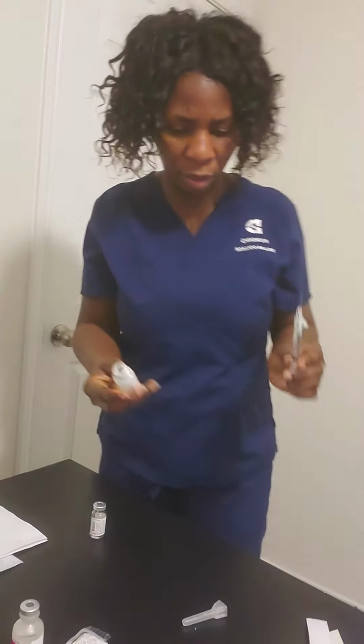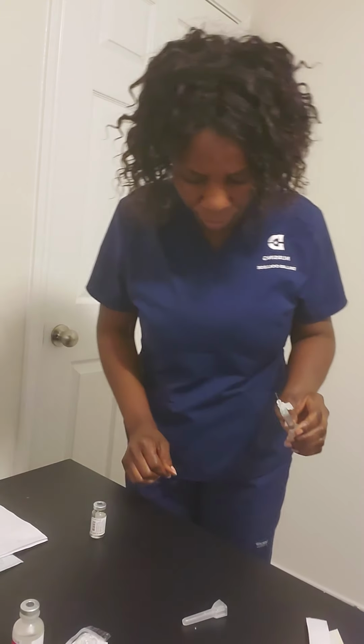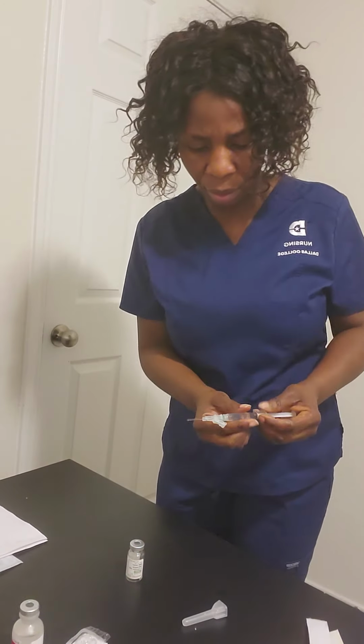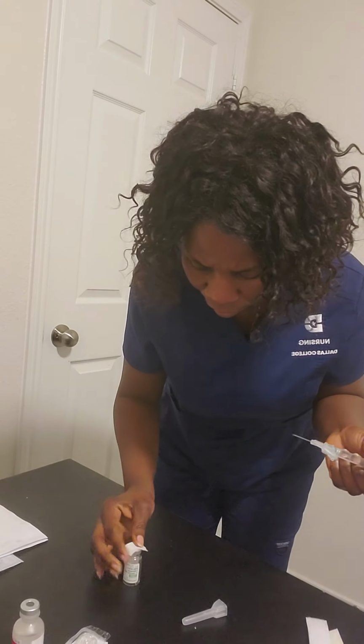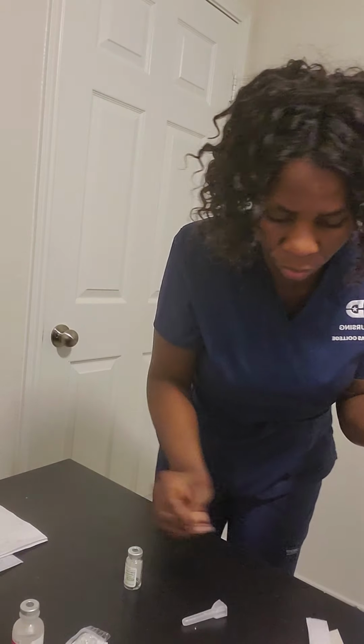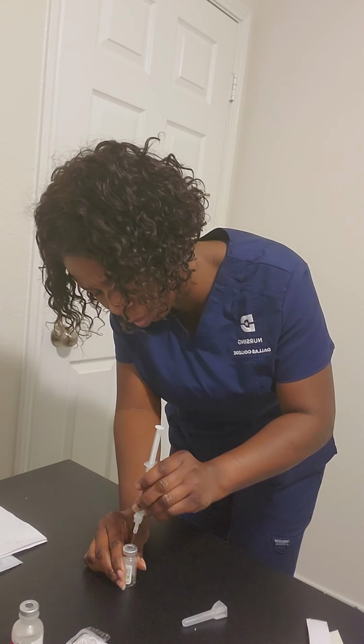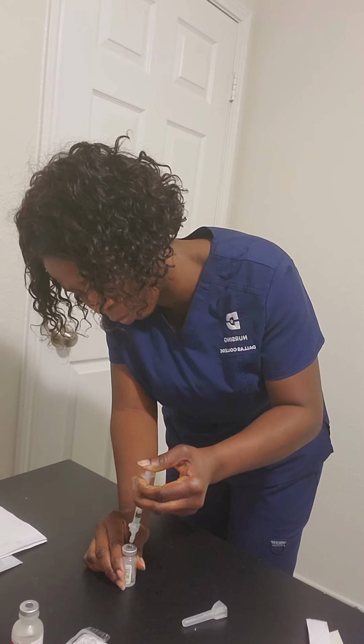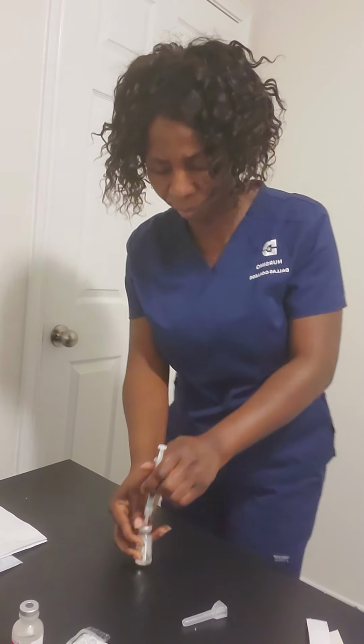I've been able to draw 2.5 ml of sterile water. So I'm going to keep that here by taking the ceftriaxone. I'm going to wipe again. So I'm going to drop the water straight into the ceftriaxone. So I've been able to drop the water into the ceftriaxone.